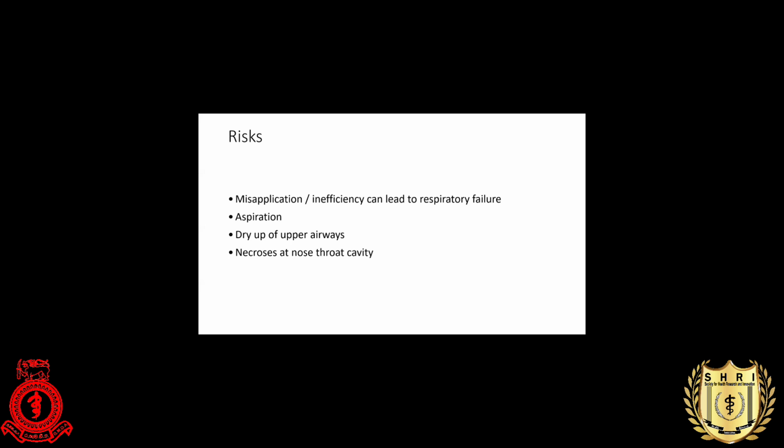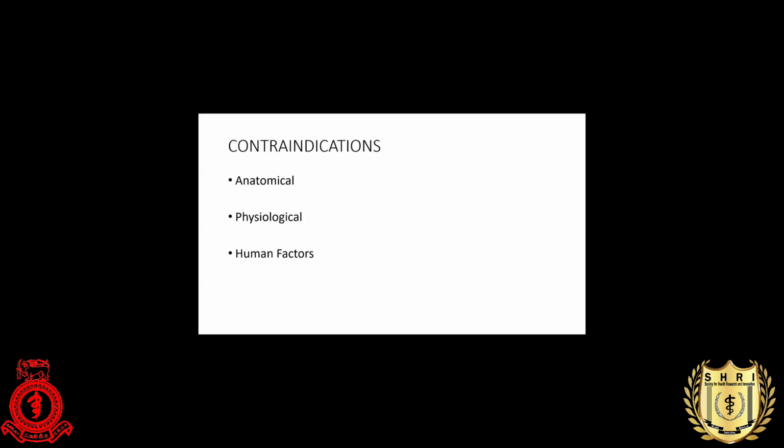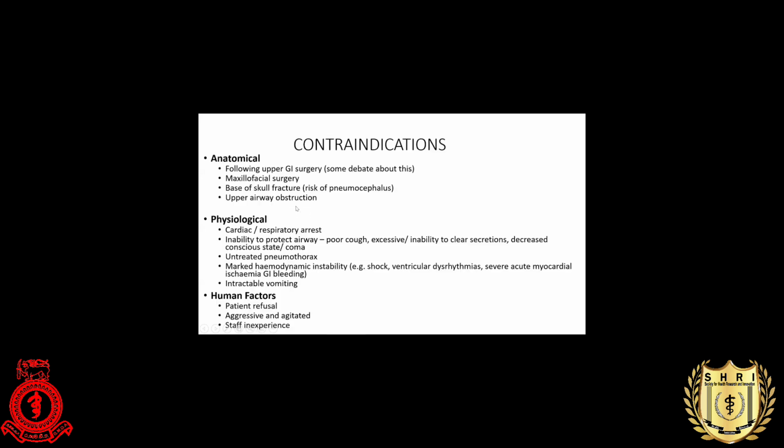What are the contraindications to using non-invasive ventilation? You can categorize them as anatomical, physiological, and human factors. Anatomical means if the patient has had recent upper airway or GI surgeries, we do not use it. Also maxillofacial injury or surgery, base of skull fracture, or airway obstruction.